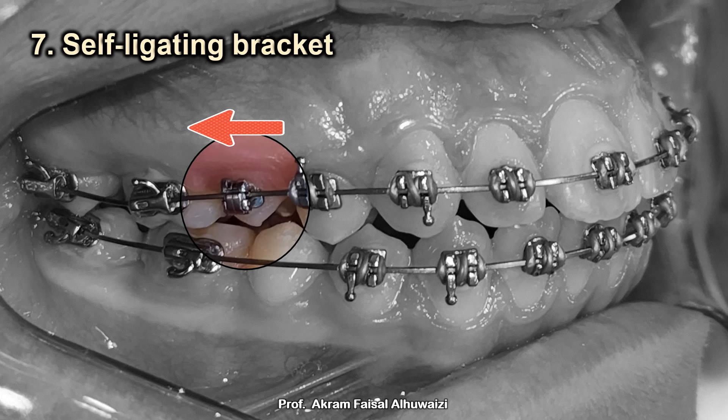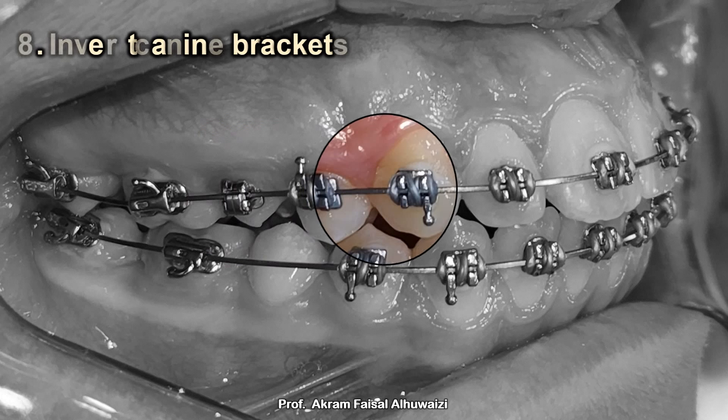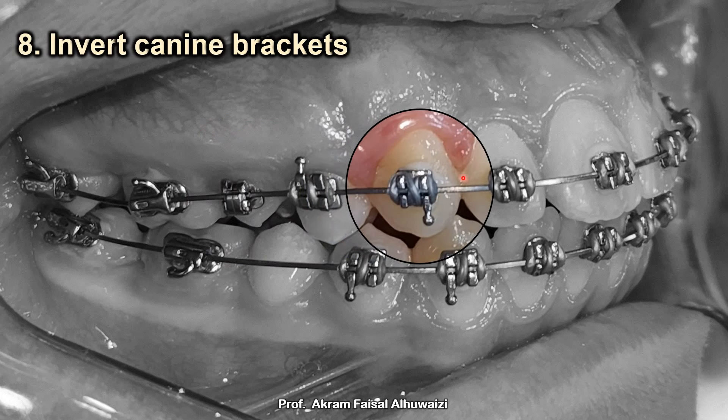Tip number eight: invert the bracket on the upper canine. This is especially important when there is root bulging, which I notice particularly in adults. In the MBT system the upper canine has a minus seven torque, meaning the root is pushed labially toward the cortical bone. But in an extraction case you want to retract the tooth and push the root toward the cancellous bone, so always invert the canine bracket to give it a plus seven torque.